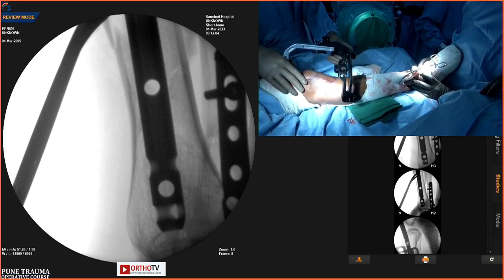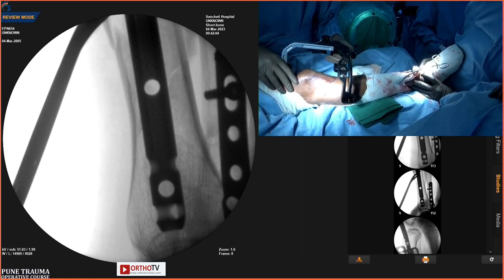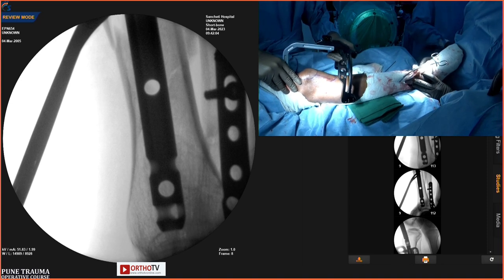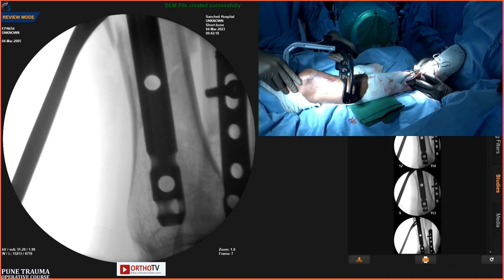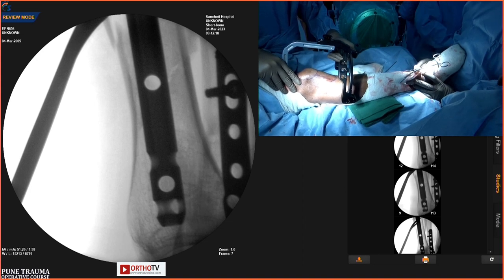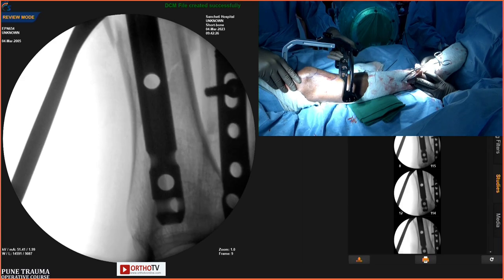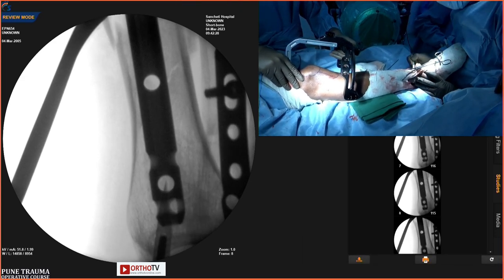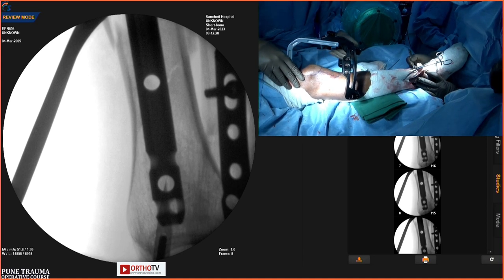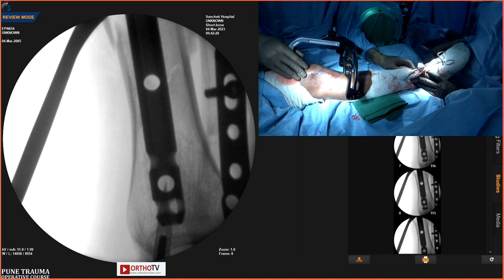If you planned a plating, will you do the fibula first or the tibia first? Sir, we did that discussion earlier, so his question is a follow-up on that. And what I'm trying to tell him is that what we've done here is a temporary stabilization of the fibula. Once you've completed the tibial fixation, you can take a call on whether you want to improve the fibula fixation or you're happy with the fibula fixation in its current form.